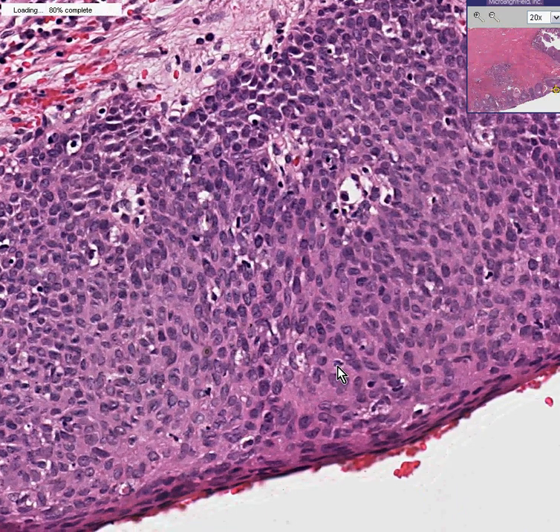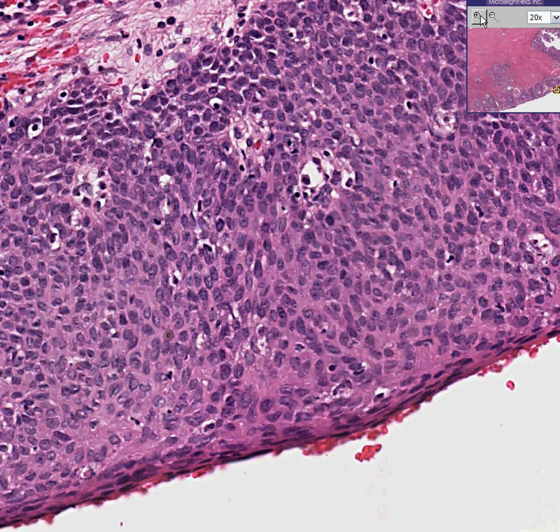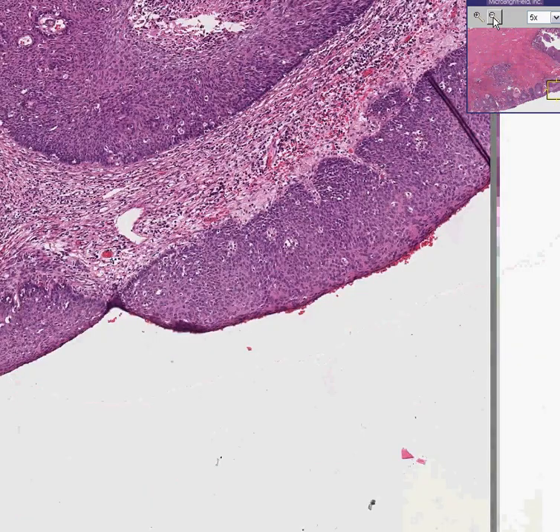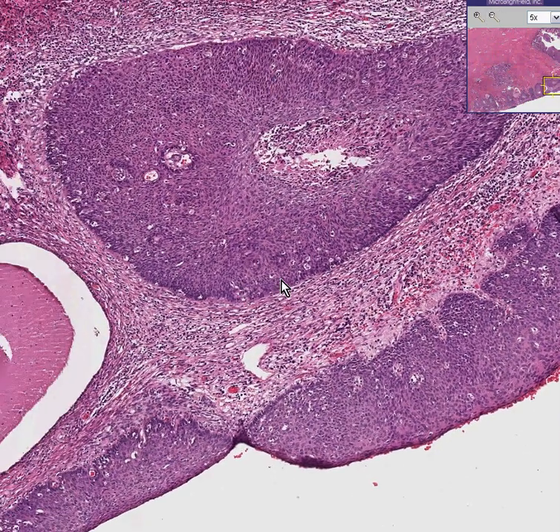You won't have a hard time finding cells in which the mitoses, like here and here, appear to be going in maybe two or three or four different directions, which is about as close to a diagnostic cytologic feature of malignancy as you could get. Please also notice that the endocervical glands are also involved with this carcinoma in situ.